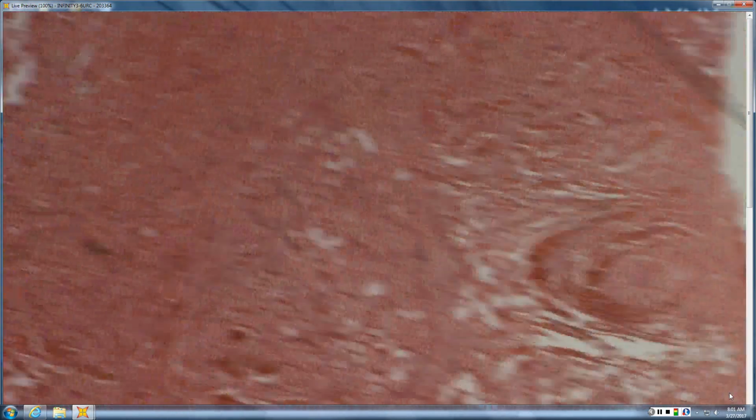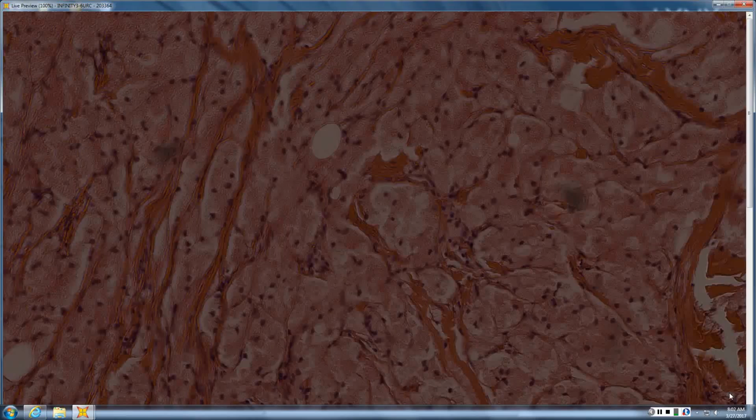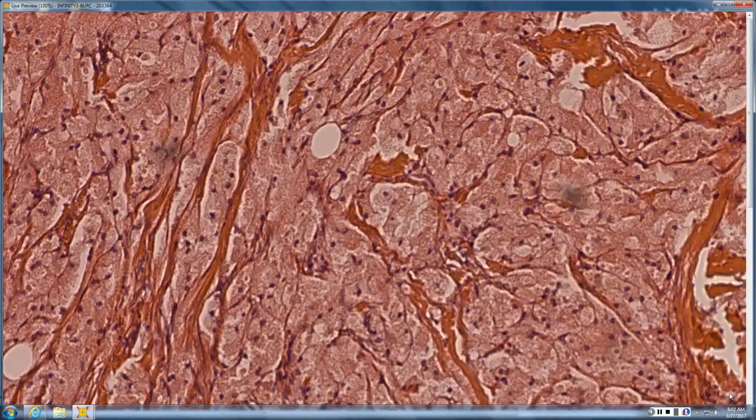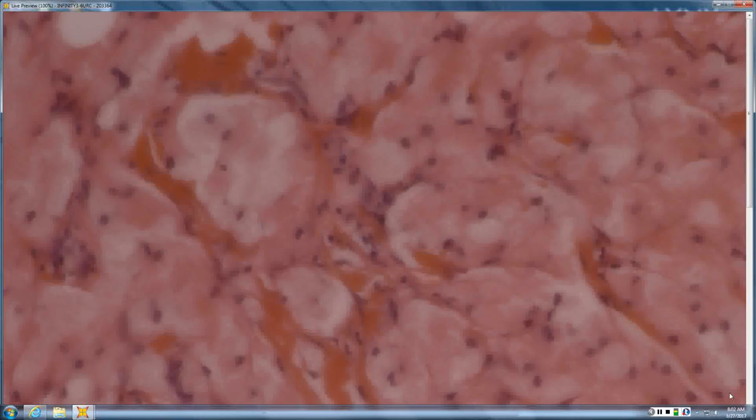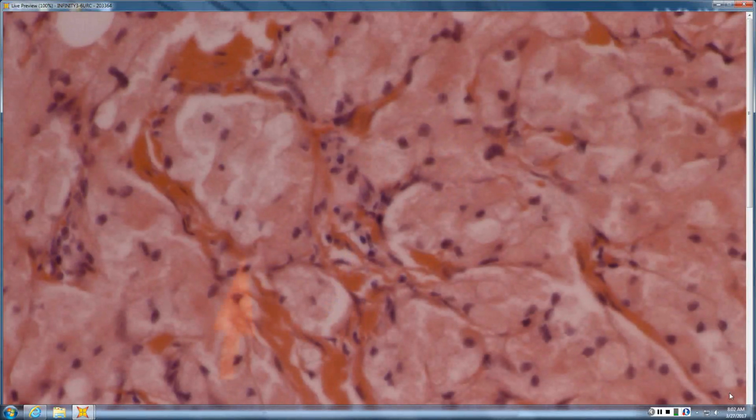Okay, how about this? So kind of a diffuse proliferation of nerve tissue. Yep. And infiltrating the fat. I mean, we just think about like a diffuse neurofibroma. Are the nuclei jumping dolphins, or are the nuclei round? Round. And then the cells themselves, why are they so grainy?